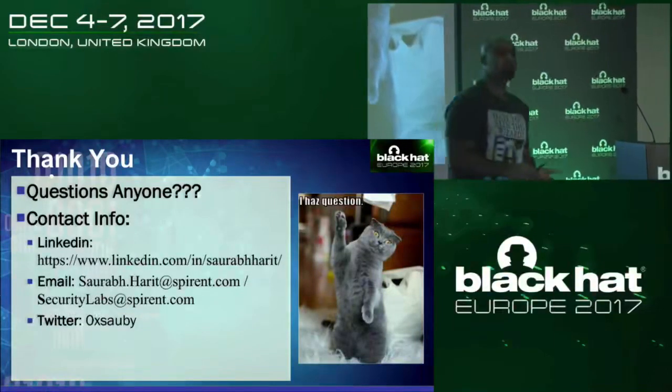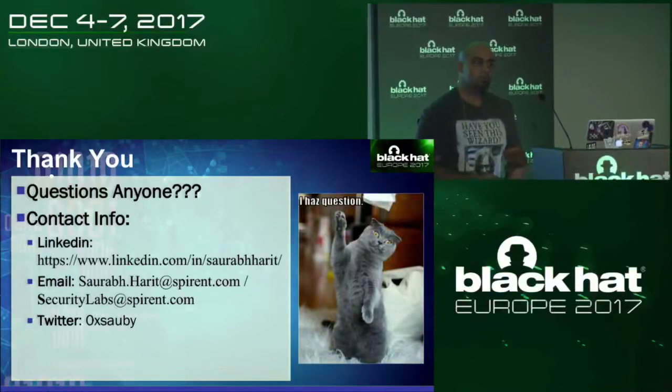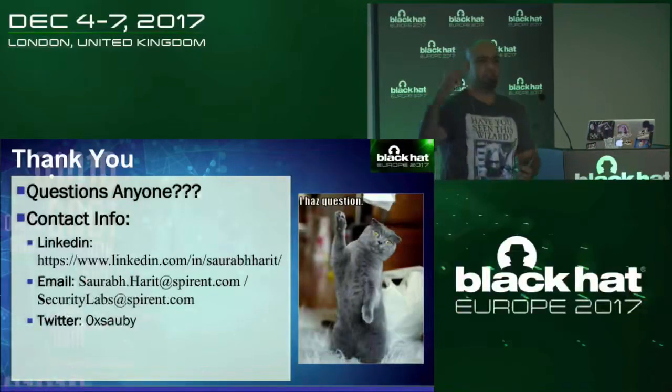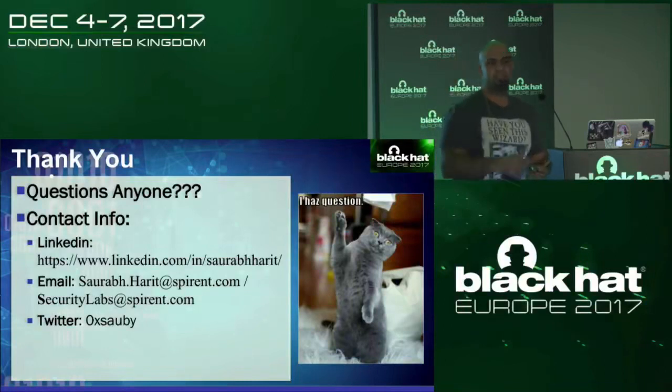Thanks for the great presentation. I'm curious, what type of encryption was used in your case study number 1? It was a proprietary encryption protocol. So that's why we had to reverse engineer the logic of the encryption. It was all reversible, so it wasn't anything fancy, but it was proprietary encryption. Okay, no crypto keys or something like this? Yeah, the key was also stored in there. So static keys. We found the code, we reverse engineered the logic of it, and then we looked for the key which was also in there that was used to encrypt the data. Okay, looks like 90s security. No, actually it looks like very 2016 and 2017.